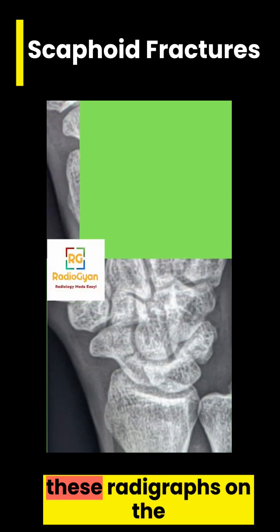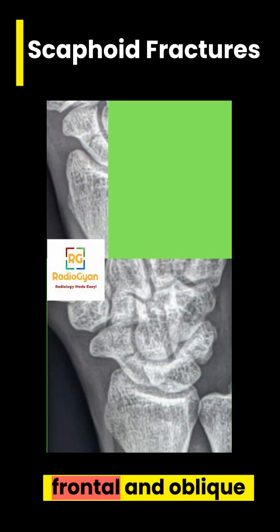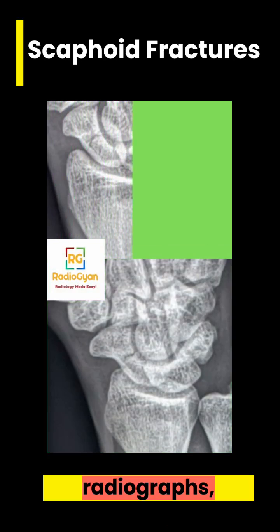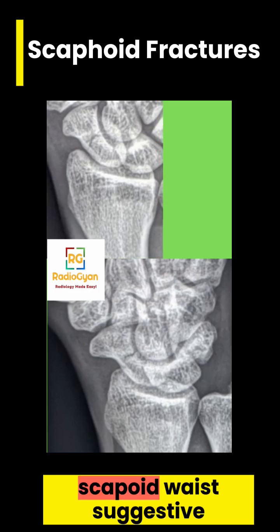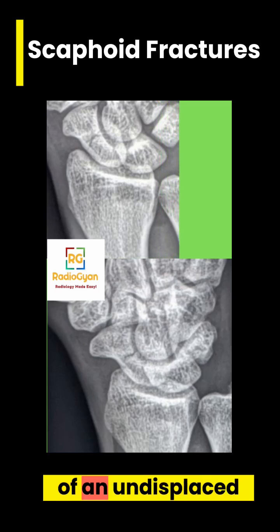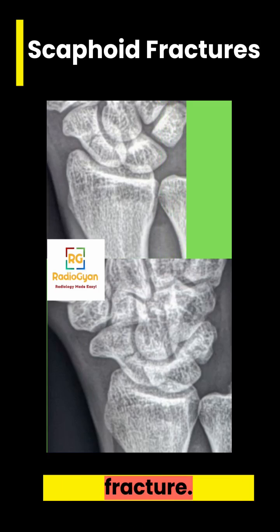If you carefully look at these radiographs, on the frontal and oblique radiographs there is a linear lucency involving the scaphoid waist, suggestive of an undisplaced fracture.